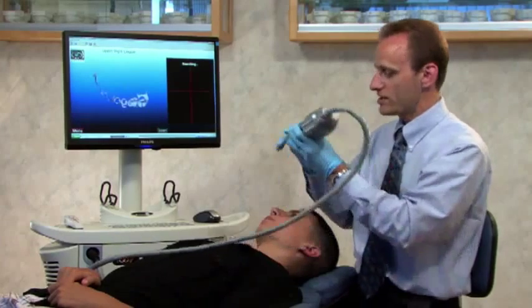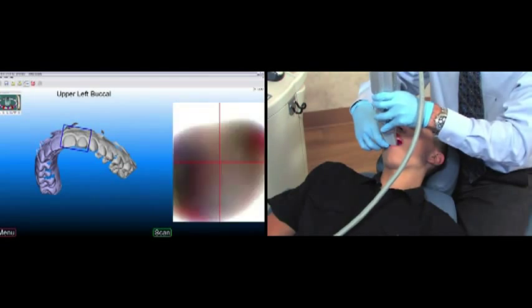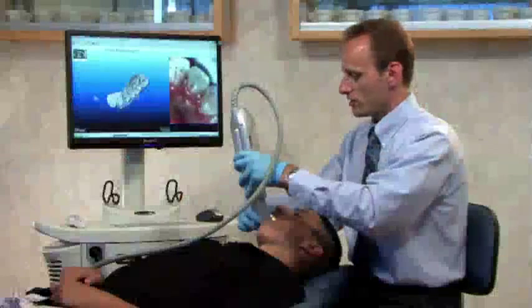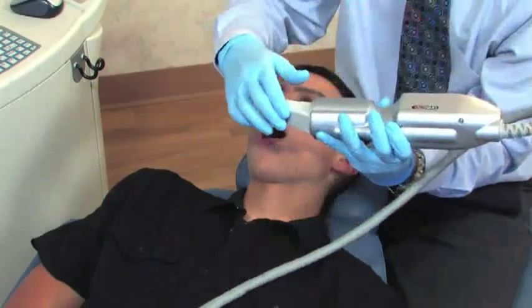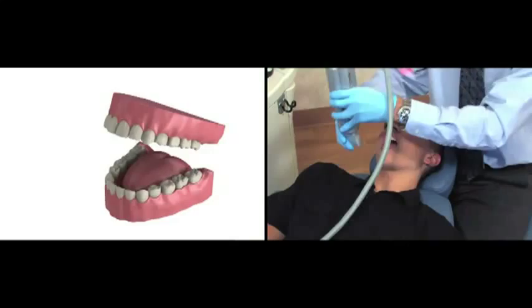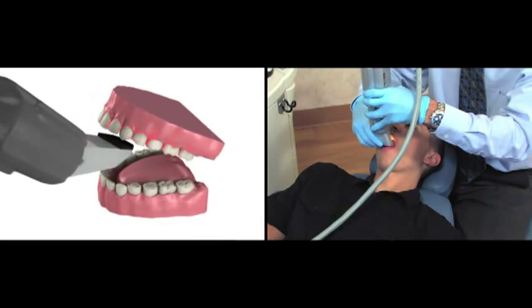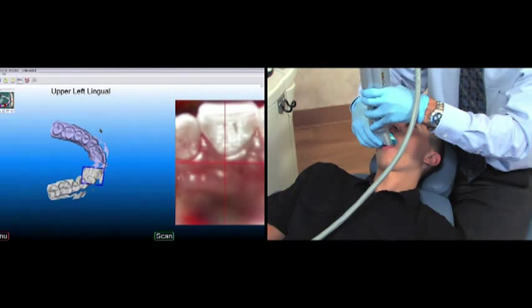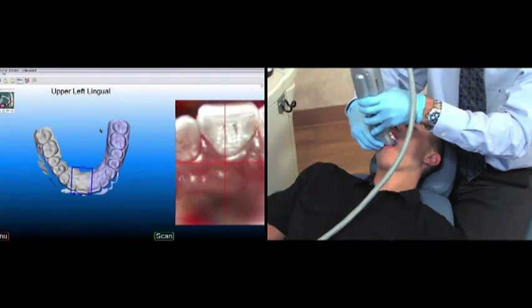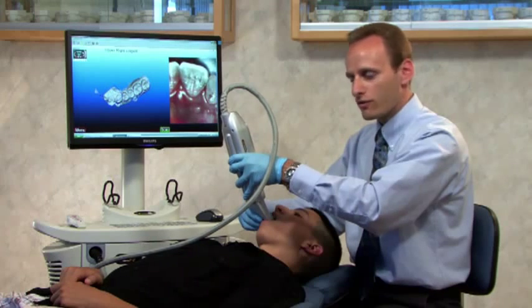Press green to go to the next segment. Now, unlike the lower, when I get to the anterior of the upper, I'm not changing the orientation of the scanner — I'm no longer following the arch from the lingual side; I'm keeping a vertical orientation. You may notice in the viewfinder it may not be in perfect focus all the time, and that's okay. The viewfinder is purely for positioning purposes. When we take a scan, it is always in perfect focus as we capture at over 300 focal depths.